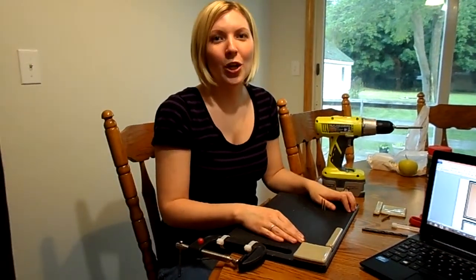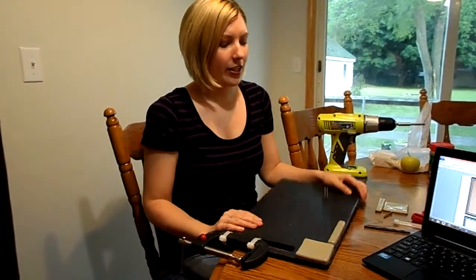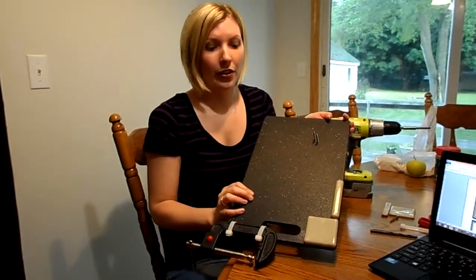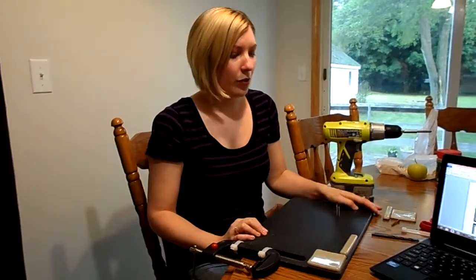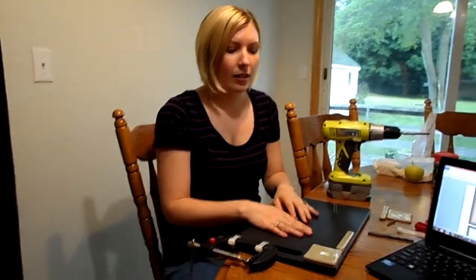Everybody, today I'm going to show you how to make and use an adapted cutting board. Here's an adapted cutting board. This can be useful for people that have trouble with using both hands or somebody with visual impairments.